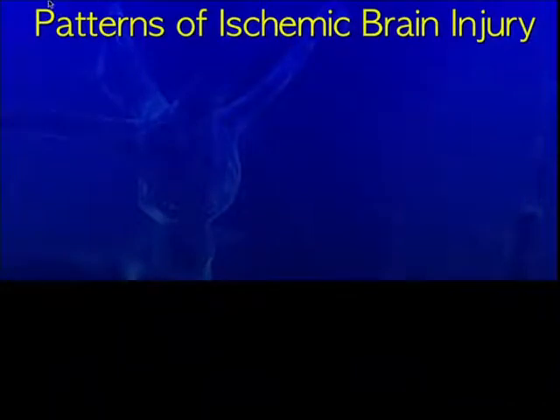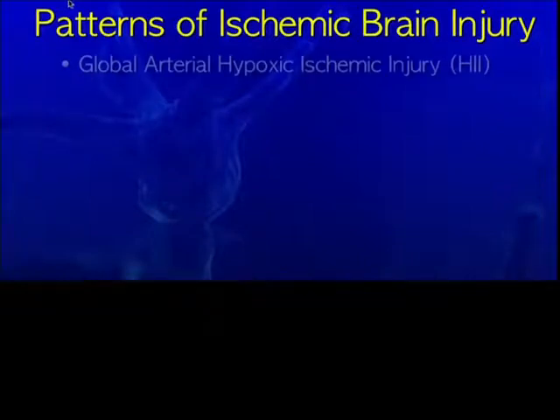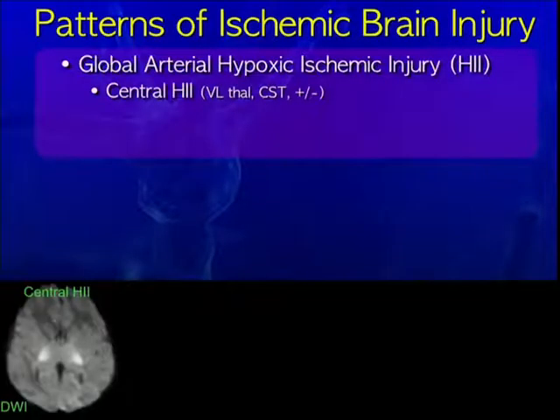All right. So I'm taking a slightly different tack than Dan, focusing on what I would be thinking as a clinician sitting in the reading room. And first thing we think about are patterns of injury to try to give us some idea of the mechanism that led to the injury.